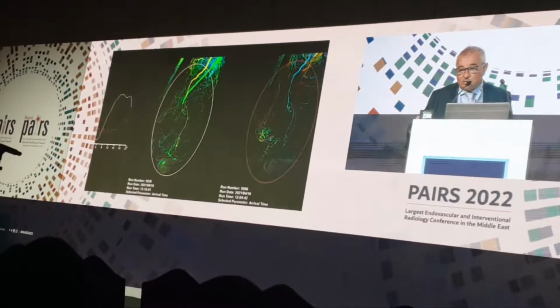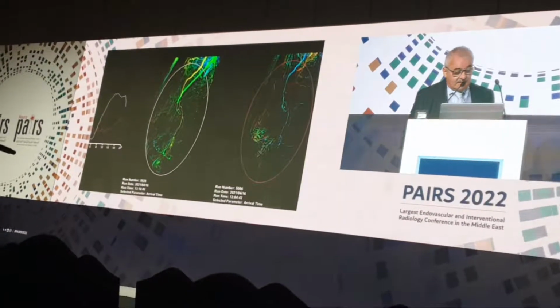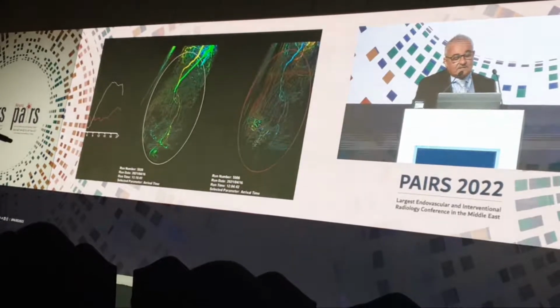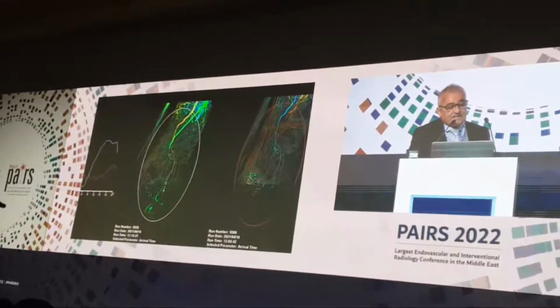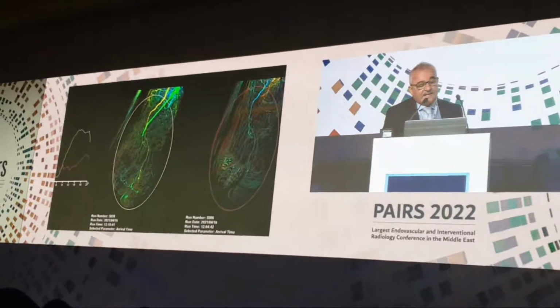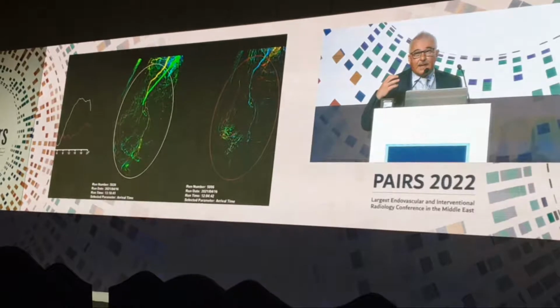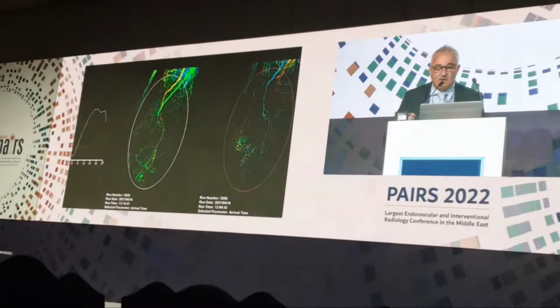So this is the final 2D perfusion, and you can see how different these two curves are. There are some movement artifacts, but anyway, you can see the contrast medium arrives very early in the foot, and the density of the contrast medium in the forefoot, especially, is a blushing effect that could suggest the efficacy of our procedure.